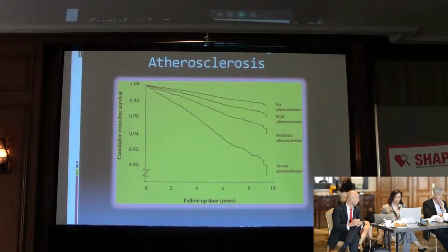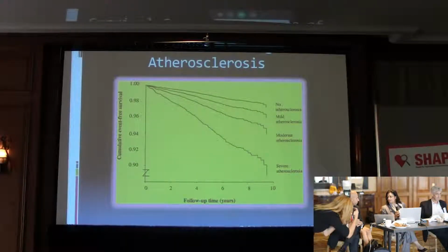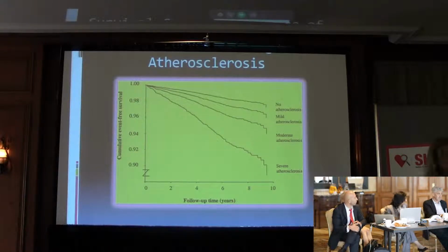It's not easy. Well, I have talked to my colleague Costley from New York, who uses femoral ultrasound routinely. And according to him, the time it takes to assess femoral ultrasound is identical to the time it takes to do the carotid ultrasound. Henrik, is that possible?